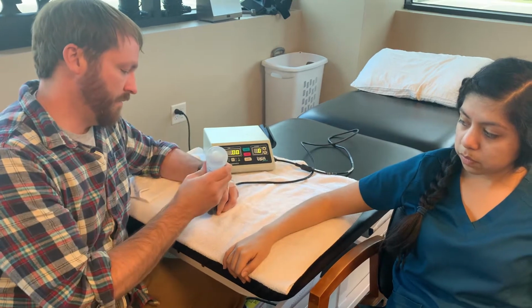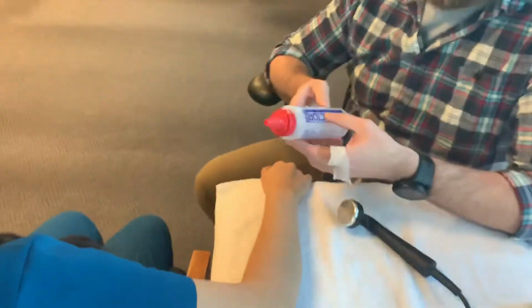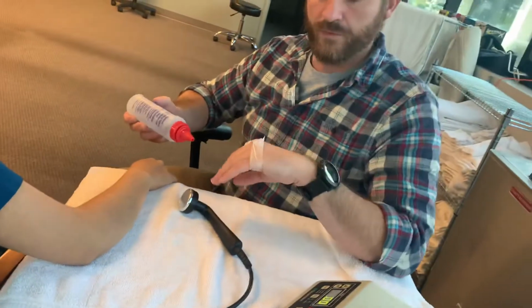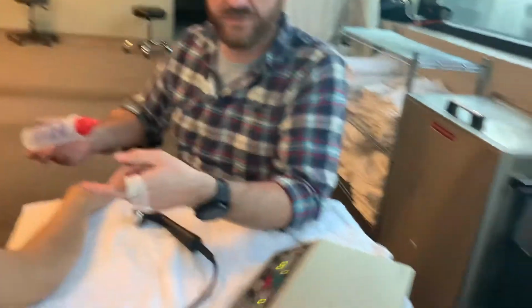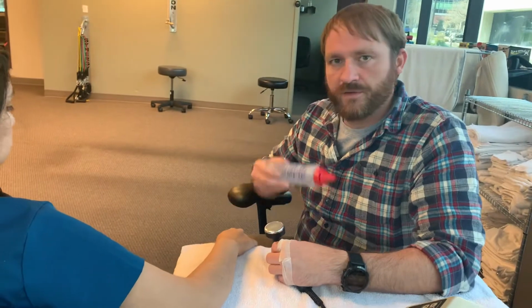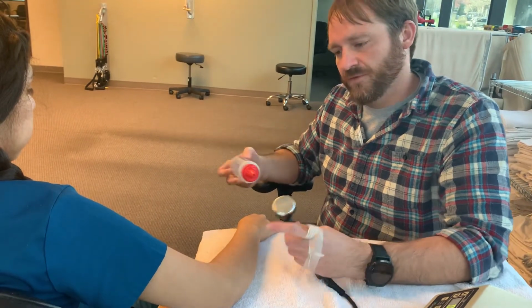So what we're going to do, you can do it one of 2 ways. You can either put the transmission medium directly onto the skin or onto the ultrasound. The important thing is to apply that and apply the head to the area before you actually start the ultrasound. Because we have a piezoelectric crystal in here that's creating that ultrasound, creating those waves that go through the skin.